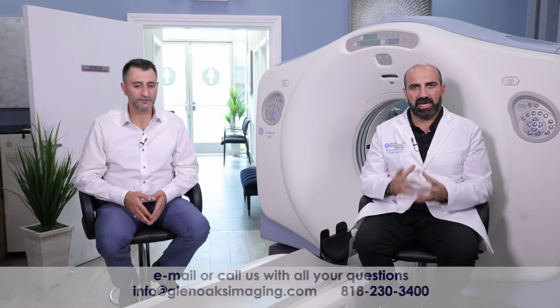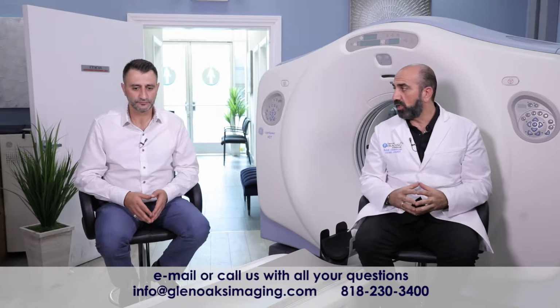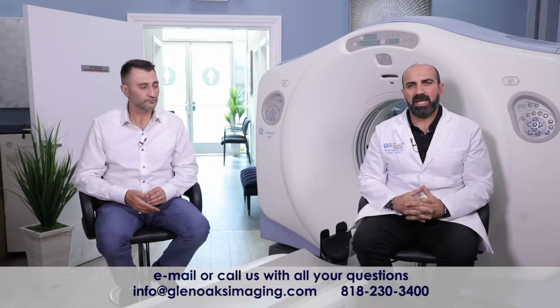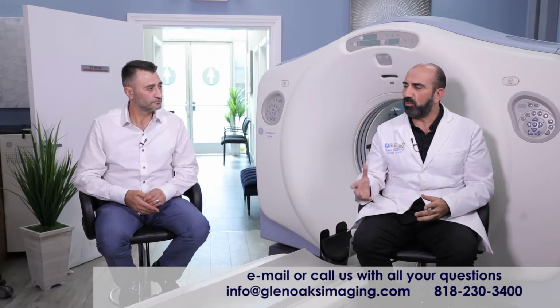But CAT scan uses an X-ray tube, just like your regular X-ray, but uses three-dimensional imaging. Andre will explain in more detail. And MRI, as we talked about in our previous web series, uses magnets, antenna, and gets the signal from the patient's body water. Now we'll have Andre detail exactly.